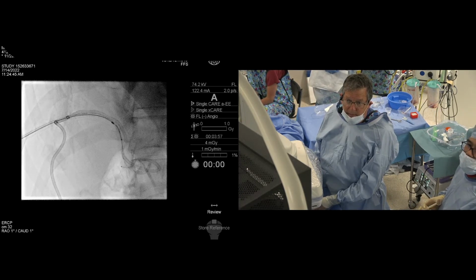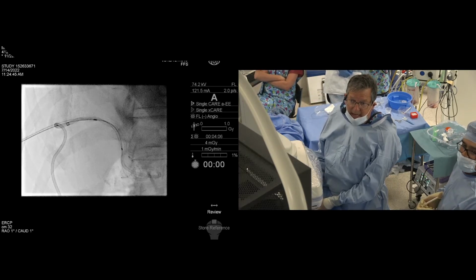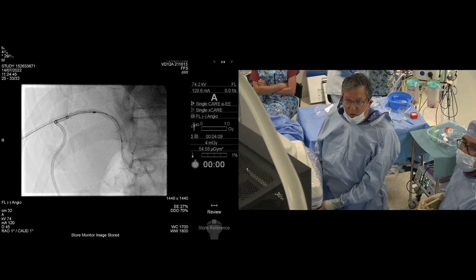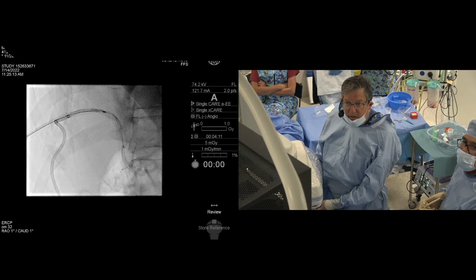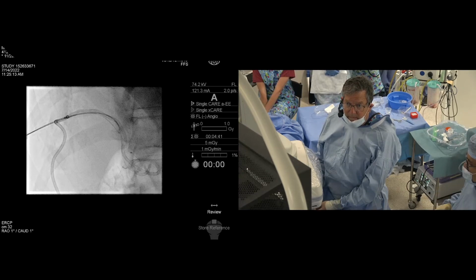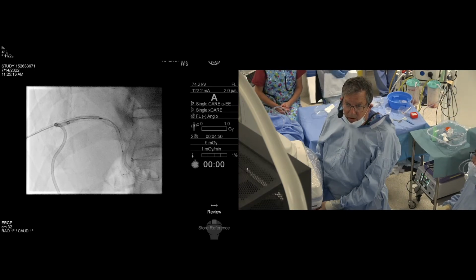And as we open the brush, I'm coming back with the catheter. Opening. Yeah, beautiful. Okay, excellent. And so you can see the radiopaque marker at the tip of the brush, and then the end of the catheter sheath, also radiopaque, 4 or 5 centimeters further back. And I'm just going to do a little jiggle backwards and forwards here, right across the abnormal tissue at this patient's anastomosis. That's very good, and this brush proceeds beautifully across this stricture. That is actually really nice. Okay, let's close the brush.